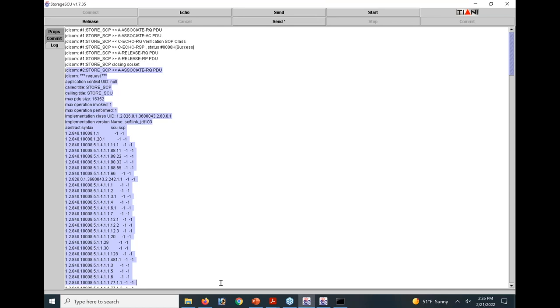Who is talking so far? Only the SCU. So the SCU said association request here, and here's how I will do it: this size, this timing, all these settings. Has the SCP even said anything yet?